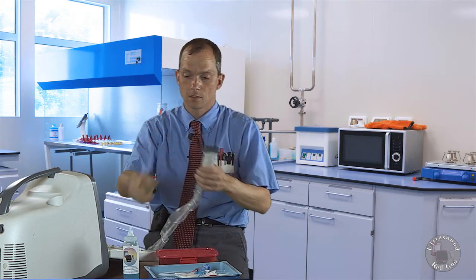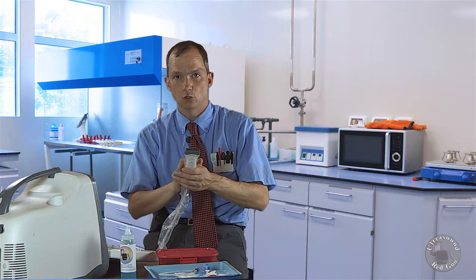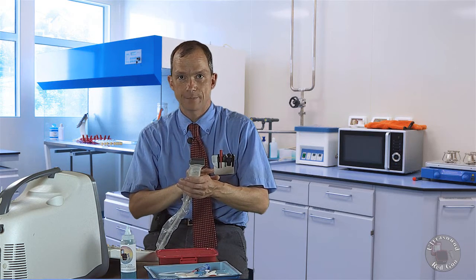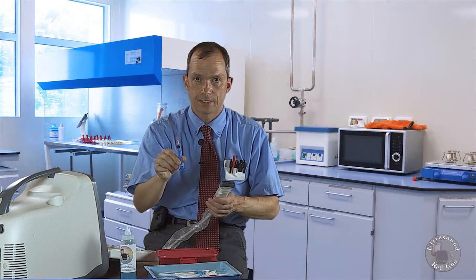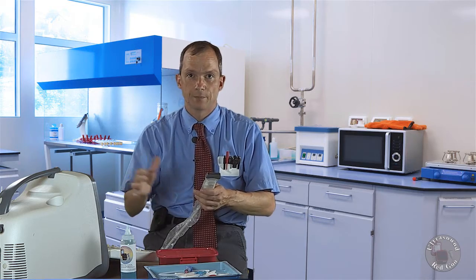What you're going to want to do now is have your ultrasound machine ready to go, your ultrasound probe ready, coupling gel. I want you to keep the ultrasound probe in your non-dominant hand. Needle is going to go in your dominant hand.